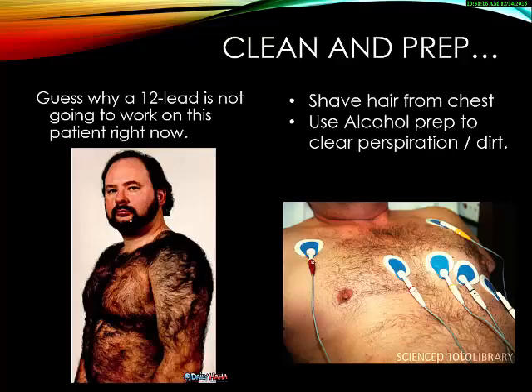All right, guess why this guy is not going to have a good 12 lead right now. All right, unless you have hedge clippers on the truck, we are not going to be able to get these stickers to stick. So it's important for us when we're getting a good 12 lead ECG to prep the chest, shave. There is a prep razor in there. Don't bother using a Bic. If you have a Bic regular razor, it's going to be clogged in about 2 seconds. So don't bother with that. We are going to be having to clear the chest off.